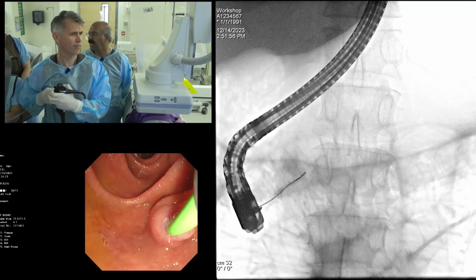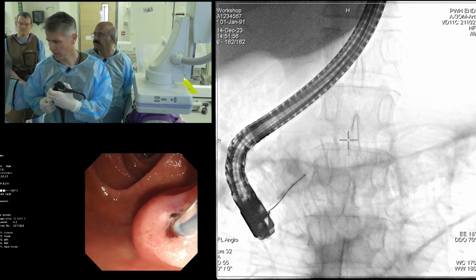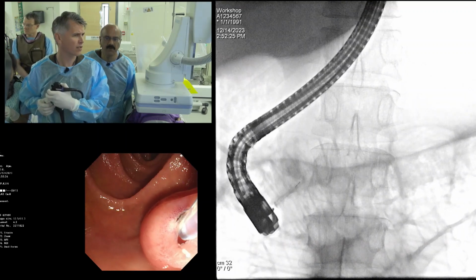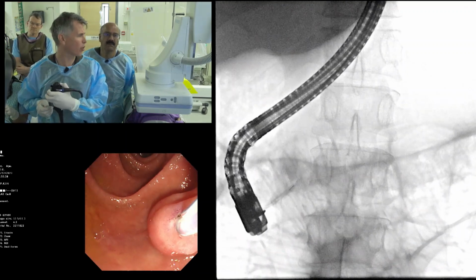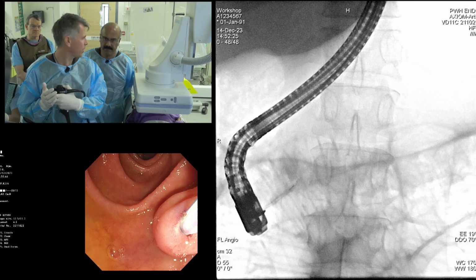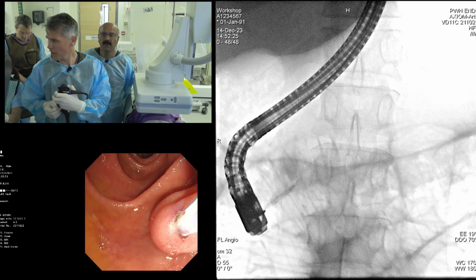So you have an angled wire? Maybe we're changing now to an angled wire. Yeah, please pull it out. Thank you. And I think, Torsten, even a pancreatoscope won't go through that bend. It's bent there completely. This is usually the problem. Even if we can advance the scope into the duct, we cannot really target the stone, because we have to cross this bending.